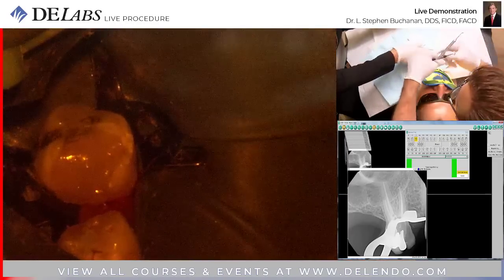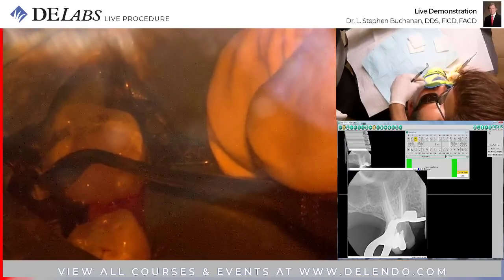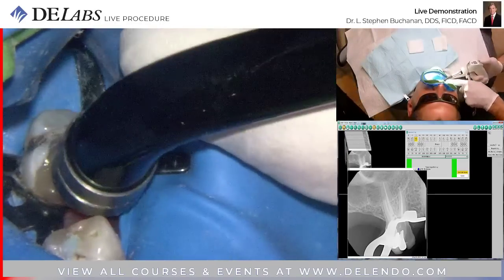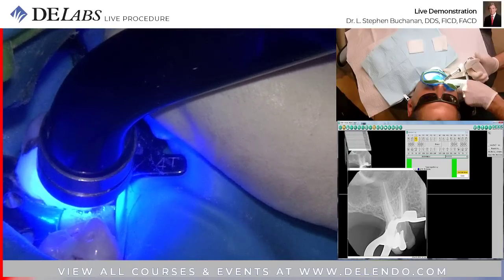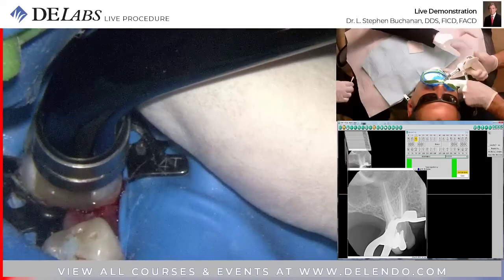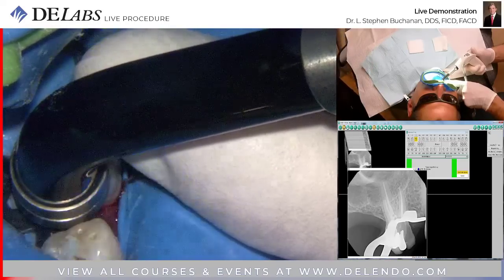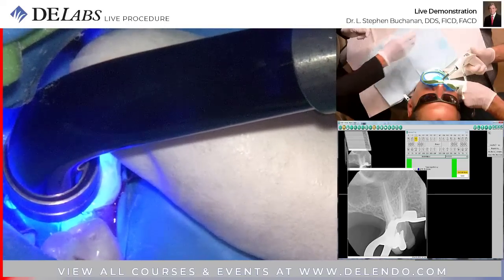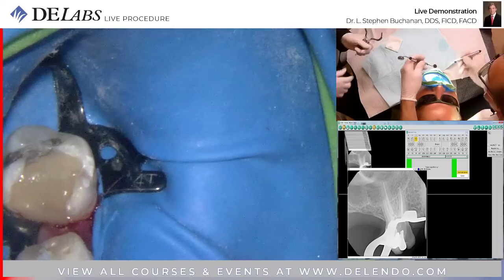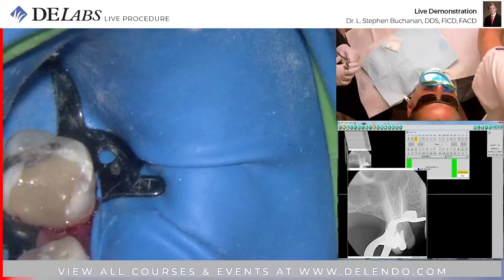Use this. Okay. 5 seconds. It's pretty good. Is that template? That's template, yes. The white stuff which you were using wasn't setting up very well with the light. Let's see. I think this clear stuff does better. Oh yeah, much better. Let's reduce the occlusion.